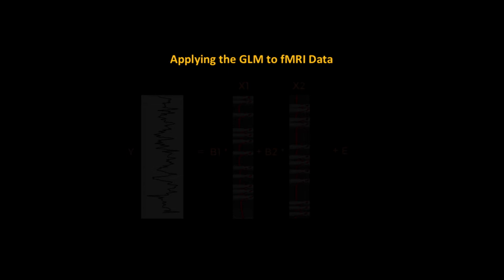Yes. Okay. Yeah. So a couple of things at the single subject level, at least, are going to determine significance: the magnitude of the beta weight, what's in the error term, and also the degrees of freedom, which is an effect of the total number of time points adjusted for things like temporal autocorrelation, and you subtract from that the number of regressors in your model. Okay, any questions about that? Because if you understand that, you're really good to go for doing this.